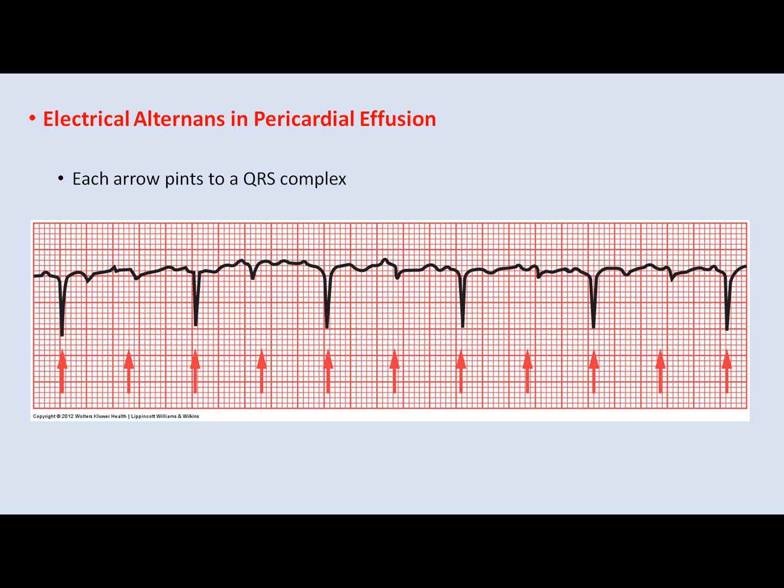What is this? This is a QRS. What's this? QRS also. QRS, QRS. What's the difference between these two? One is more normal and one is smaller.